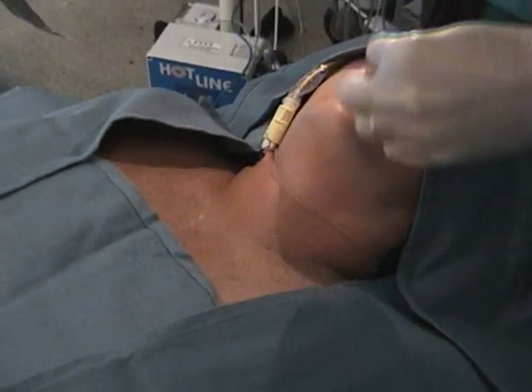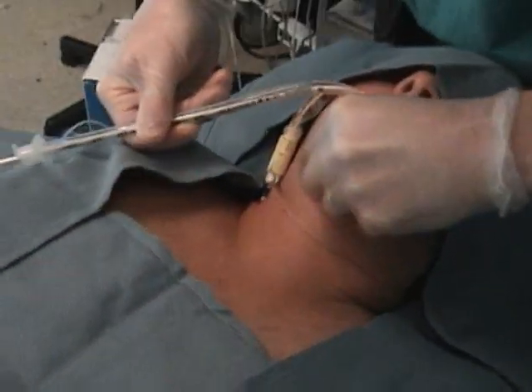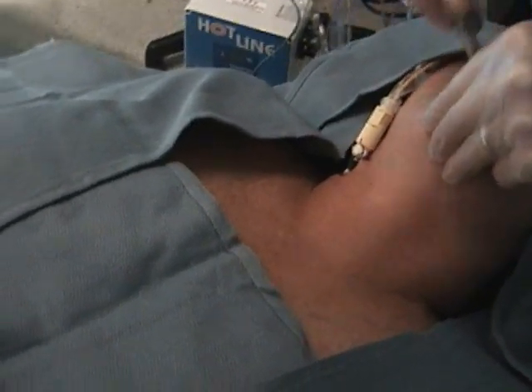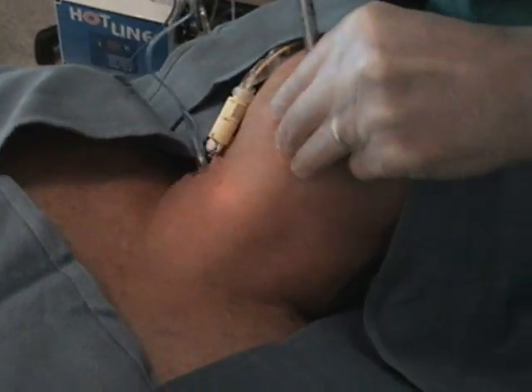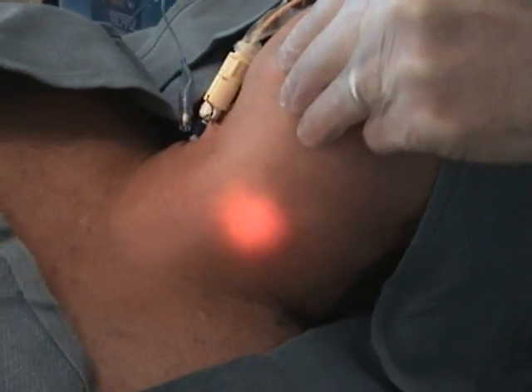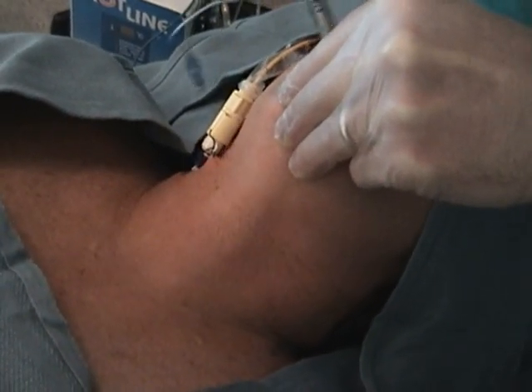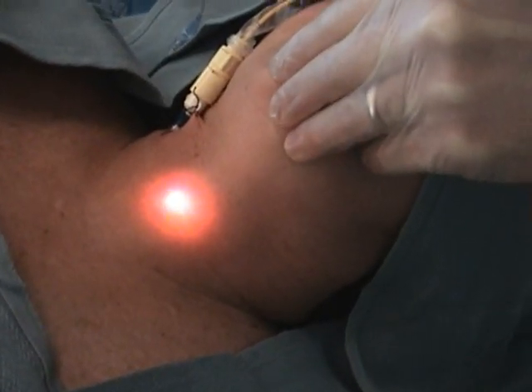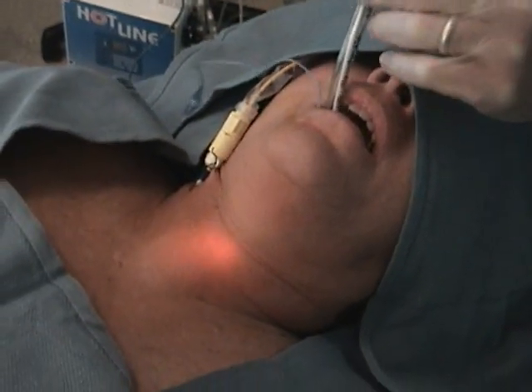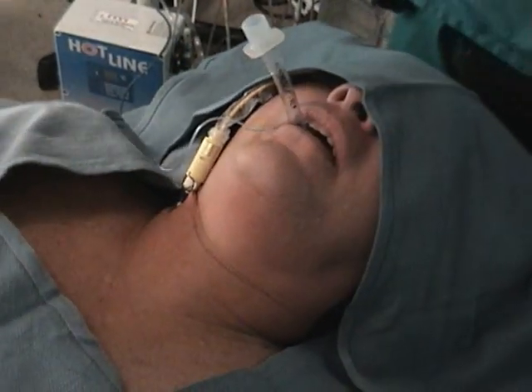The second patient is a little bigger and also undergoing open heart surgery. We pull up the jaw toward the ceiling and start with the scooping motion. You can see the transillumination clearly in this patient, and we continue the motion until the light comes to the middle portion of the neck and diffuses into the suprasternal notch — a clear sign that we are below the laryngeal inlet and vocal cords, and inside the trachea. We then withdraw the stylet and inflate the cuff before connecting to the breathing circuit.